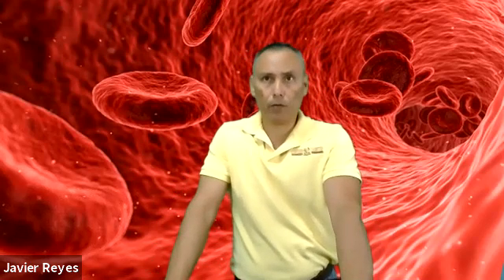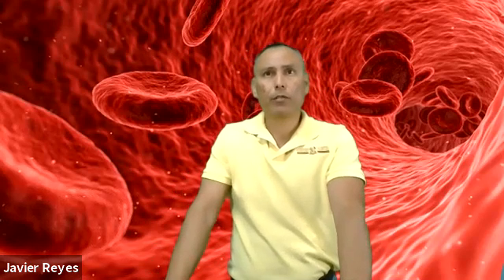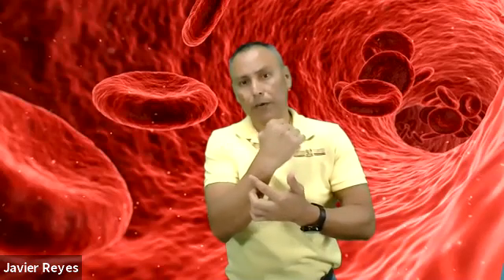The bevel penetrates a valve, preventing blood flow. This could happen usually on the veins of the hand. When you're palpating a vein and you feel or see little bumps on the vein, that is what we call a valve. This valve prevents blood from going back this way. Remember, venous flow is towards the heart, and if you see a little bump in a vein, that is a valve. You should avoid puncturing the vein at that site.